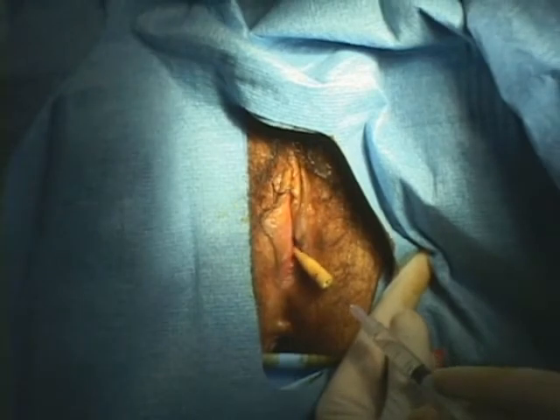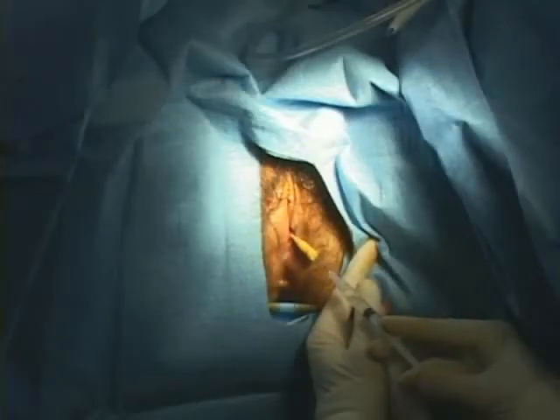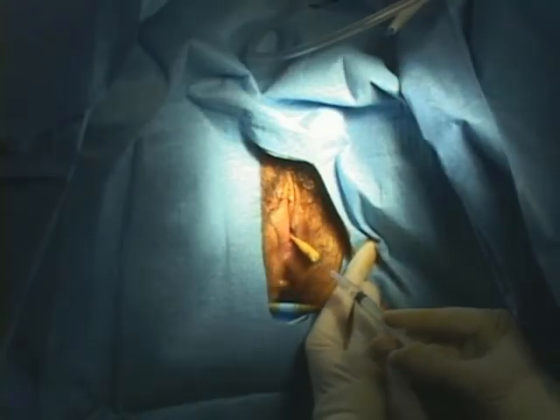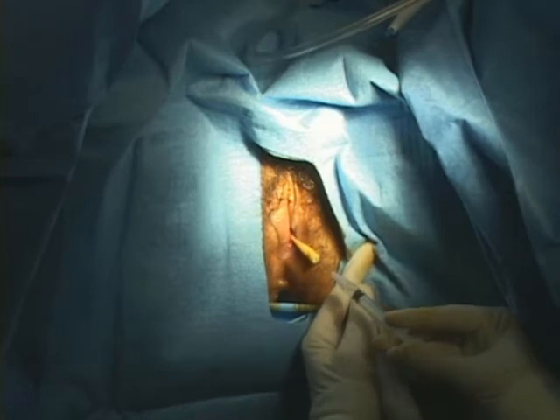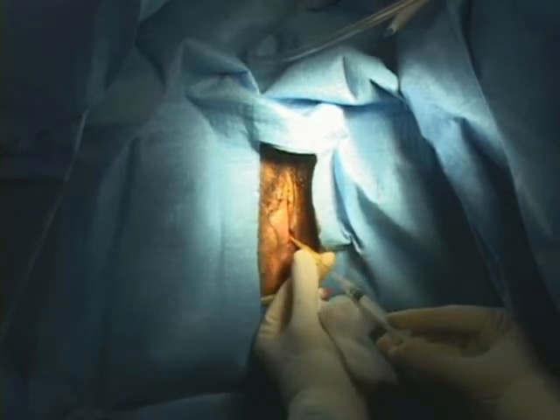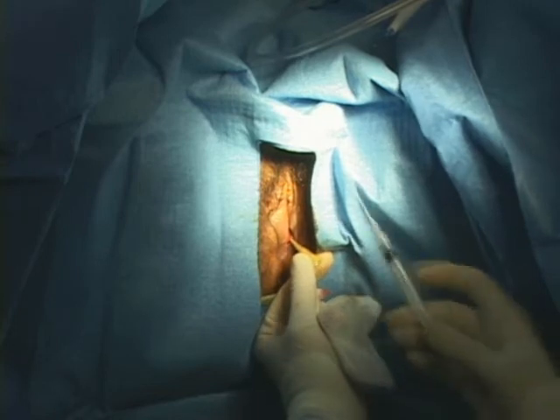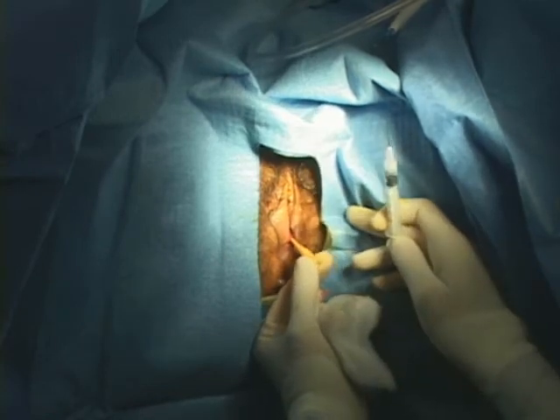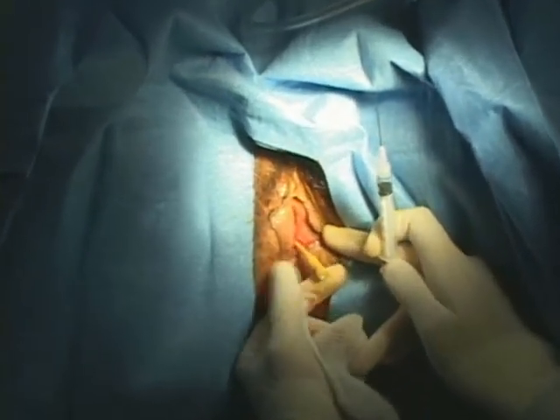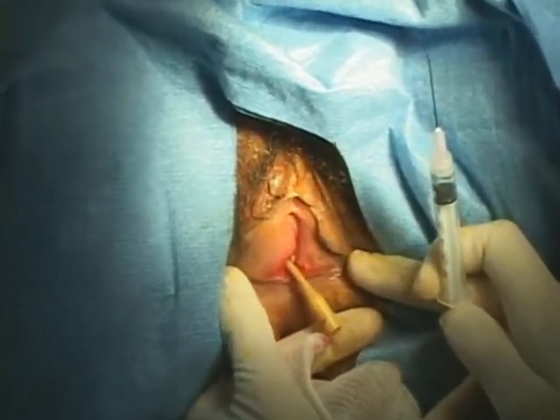Inflate the balloon with 3 cc's of sterile water and remove the needle from the base of the catheter. The catheter should stay in place and be comfortably filling the cyst cavity. Be sure not to overfill the balloon and create high tissue tension around the cyst, as this would cause significant patient discomfort after the anesthetic wears off.